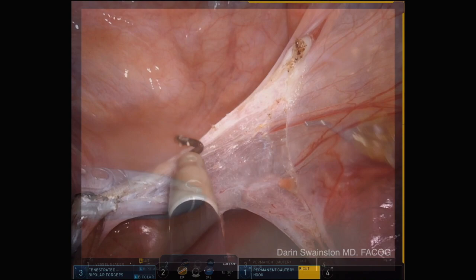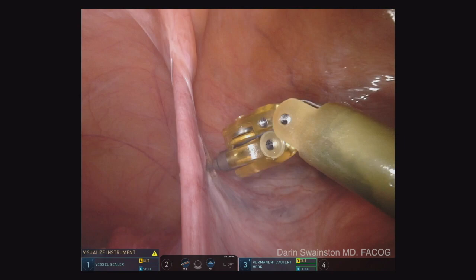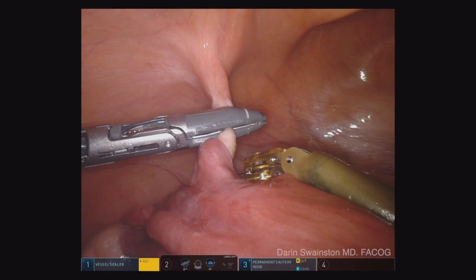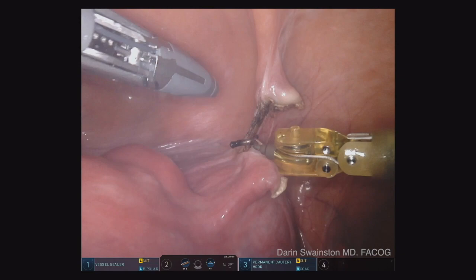This is an example of where the zero-degree scope is hard to use over big uteri. I've switched to a 30-degree down scope — I really like using the 30-degree scope now. It's my favorite way to do hysterectomies because I have more versatility: 30 degrees down, 30 degrees up with a flip of a switch, and I can rotate it right or left to see around things. I'm taking the round ligaments on both sides on this large specimen.